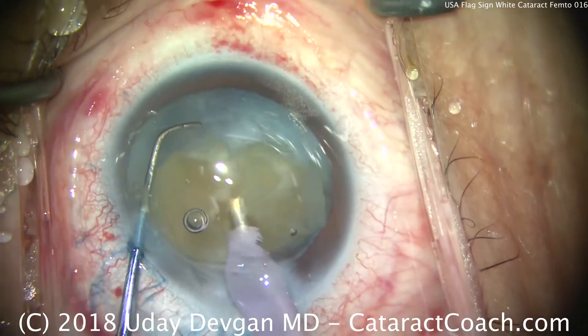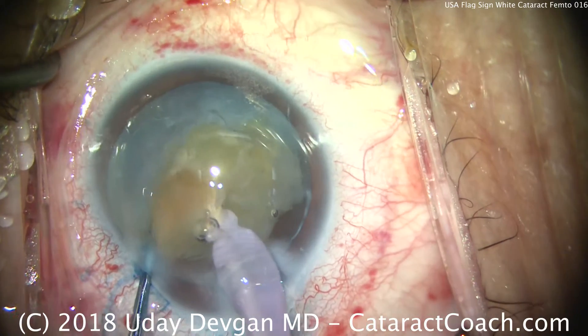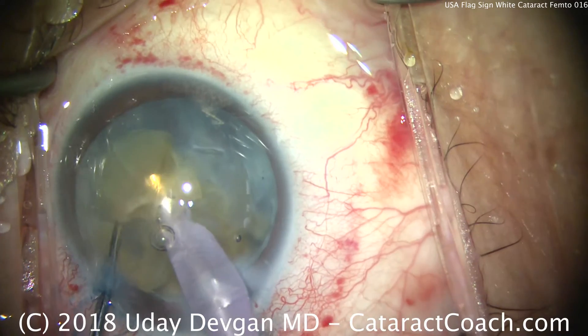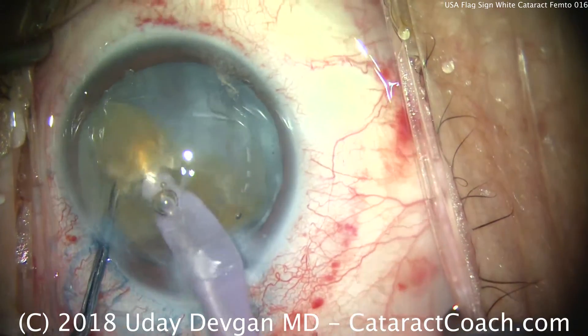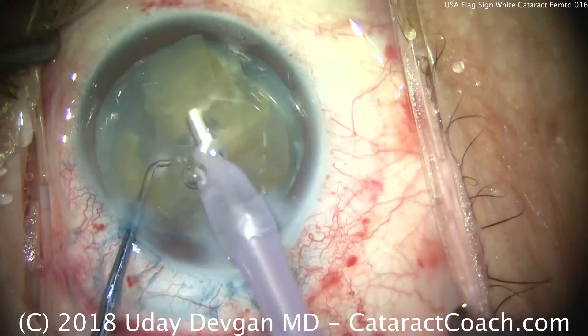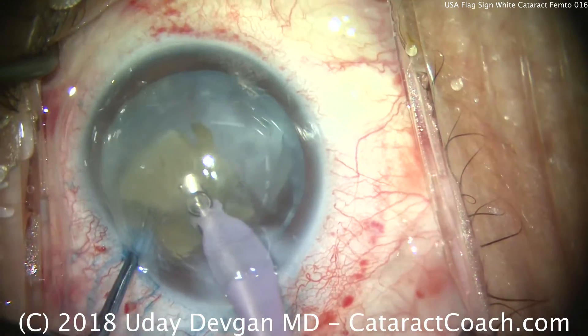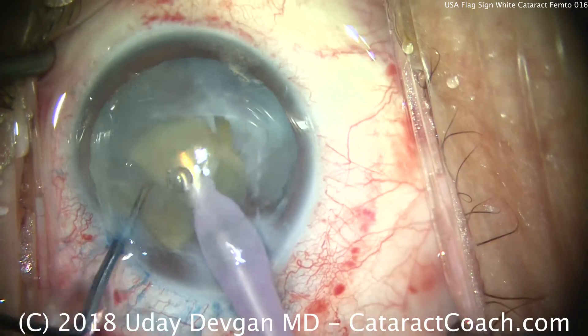The chopper is used to bring the pieces centrally and break them into small pieces. Little fragments are being aspirated down. That red subconjunctival hemorrhage ring will go away over the course of the next couple of days, and that, of course, is a side effect of using the femtosecond laser.